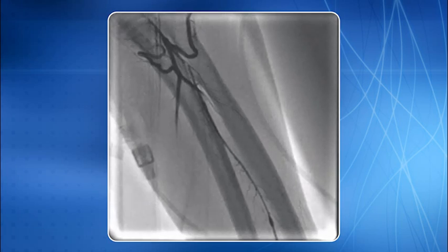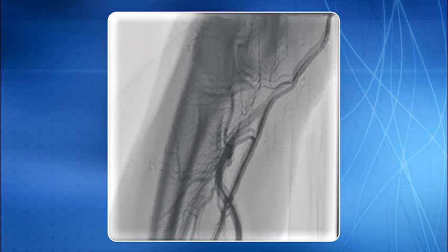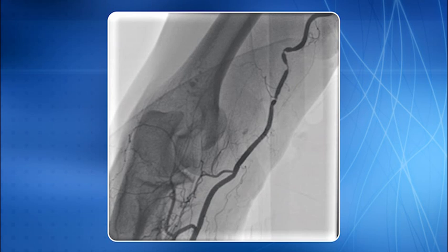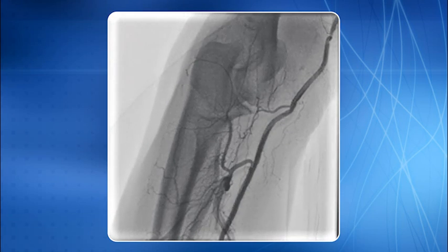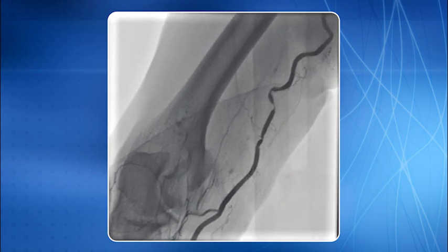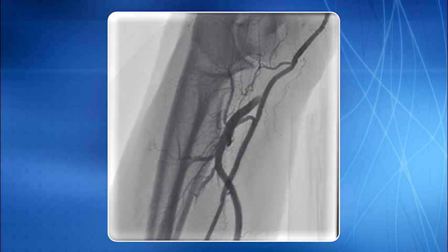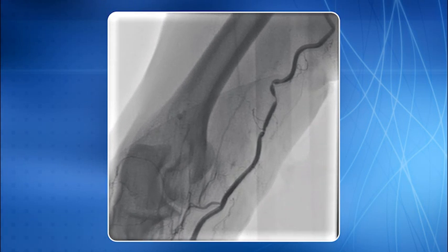Like all other arteries in the body, radial artery is not immune to atherosclerosis. You may find atherosclerotic obstructive lesion inside the radial artery also, and this is an example of atherosclerotic lesions of the radial artery. This is actually an anomalous radial artery which is arising from high axillary artery. Despite repeated doses of the cocktail, we were not able to eliminate these, and this is how we ruled out the spasm, and they were actually the atherosclerotic lesions.